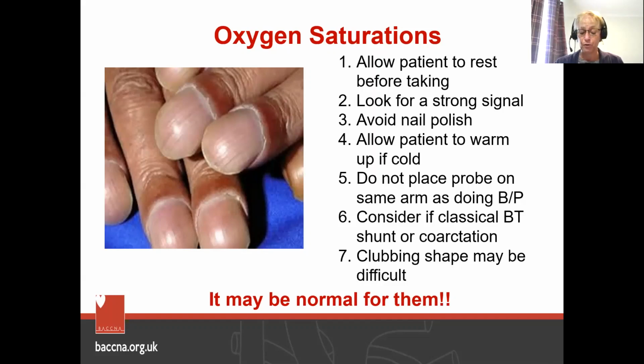It's quite often performed as part of a 6-minute walk test as well in patients with pulmonary arterial hypertension. So it's important to record whether the readings have been taken at rest, during or after activity, and in addition, whether they were breathing room air or inspired oxygen.